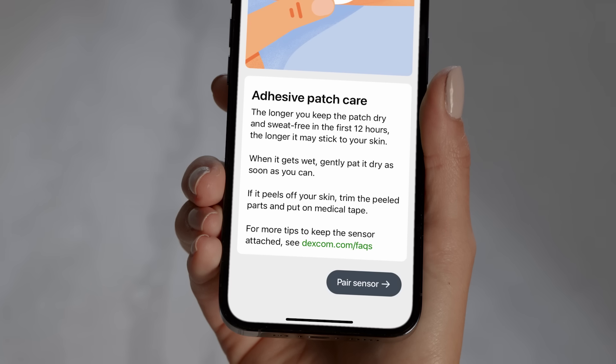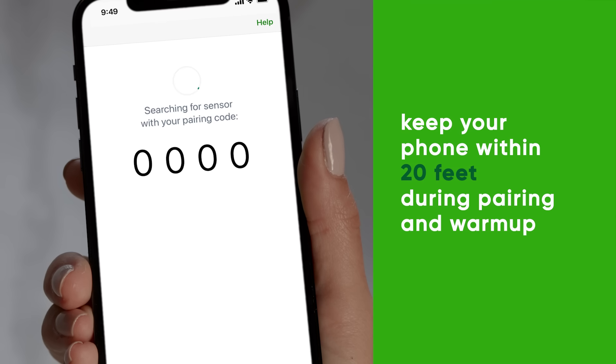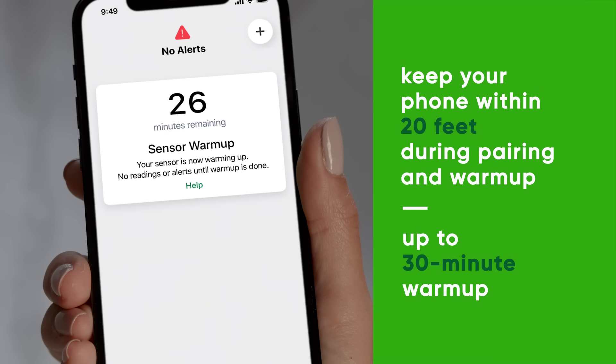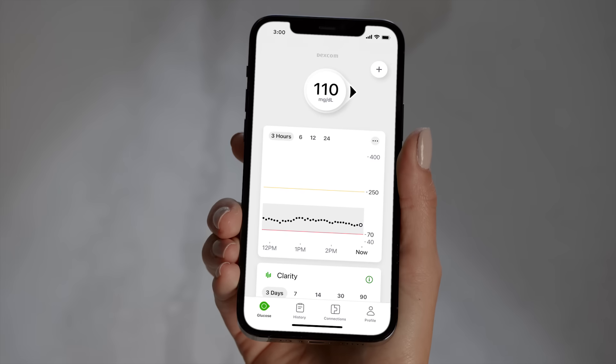Back on the app, press the 'Pair Sensor' button and wait for your sensor to pair. Once complete, you will enter into your sensor warmup. The sensor warmup timer lets you know when you'll start getting readings and alerts. After your warmup, you will start getting readings and alerts.